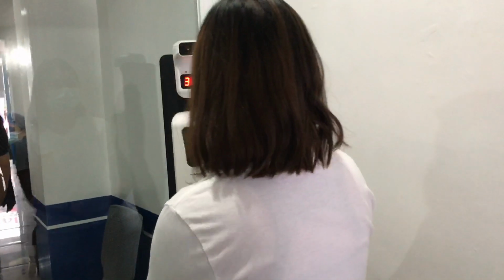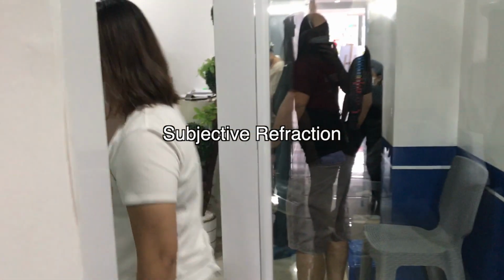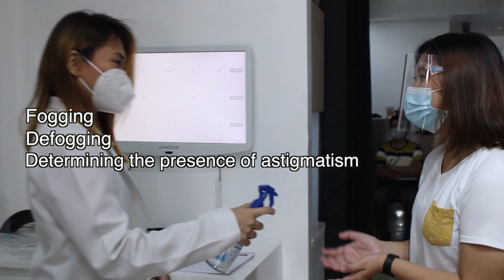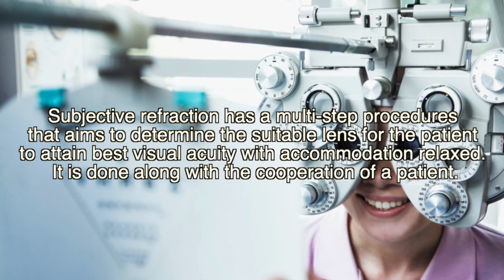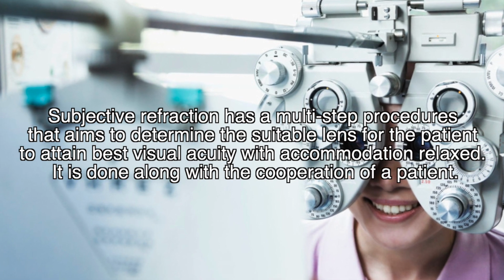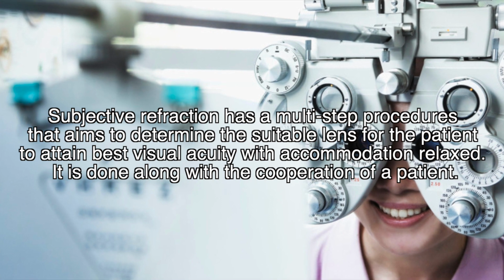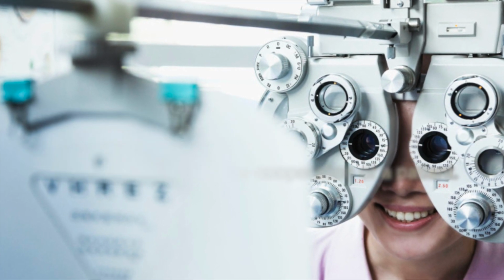Today, we're going to demonstrate subjective refraction using a Phoropter, from fogging and defogging technique up to determining the presence of astigmatism. Subjective refraction has multi-step procedures that aim to determine the suitable lens for the patient to attain best visual acuity with accommodation relaxed. It is done with the cooperation of a patient.